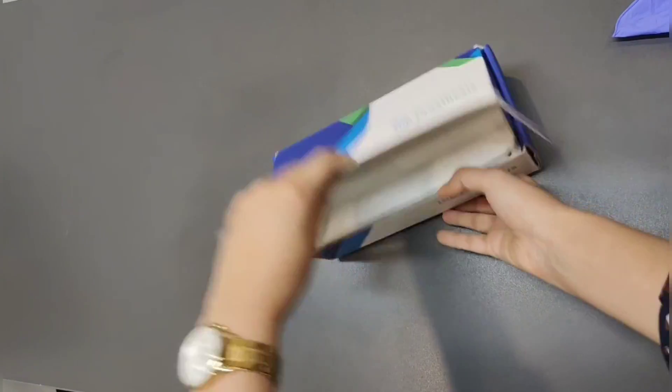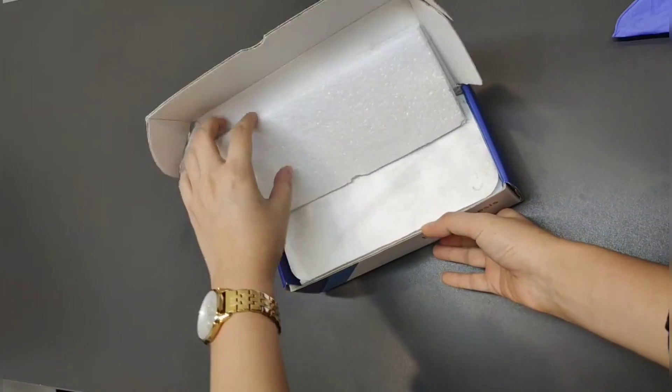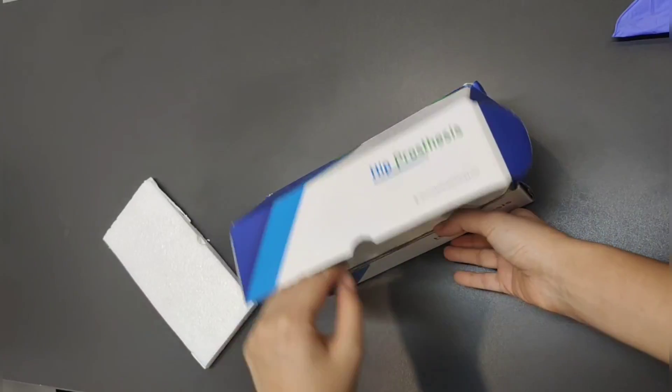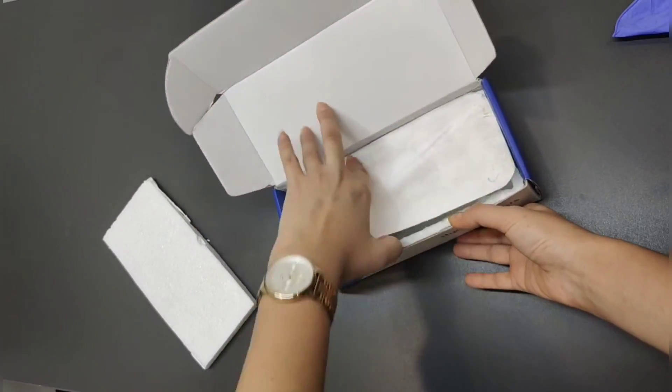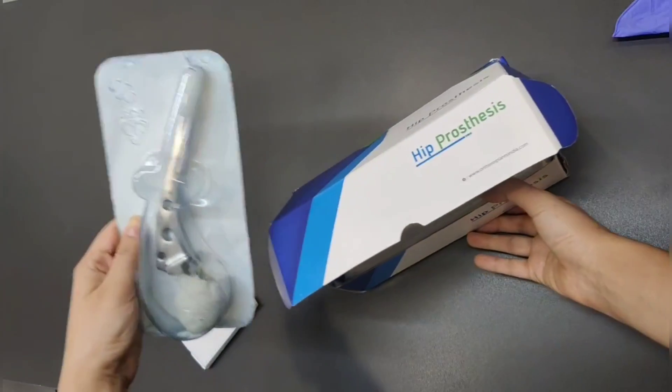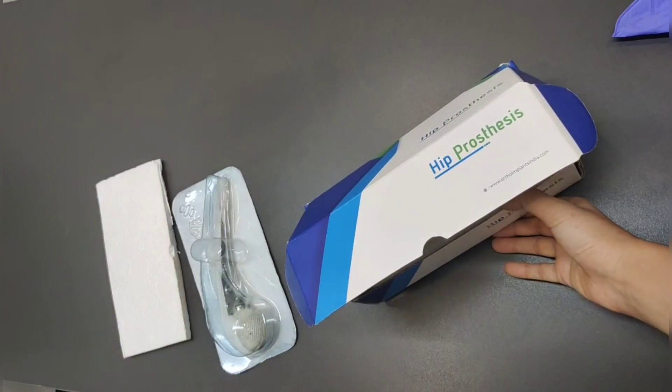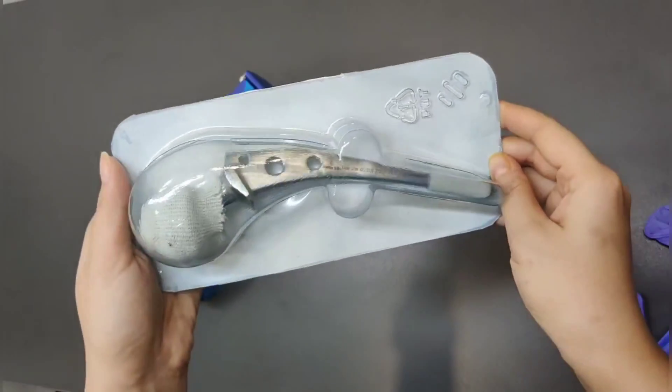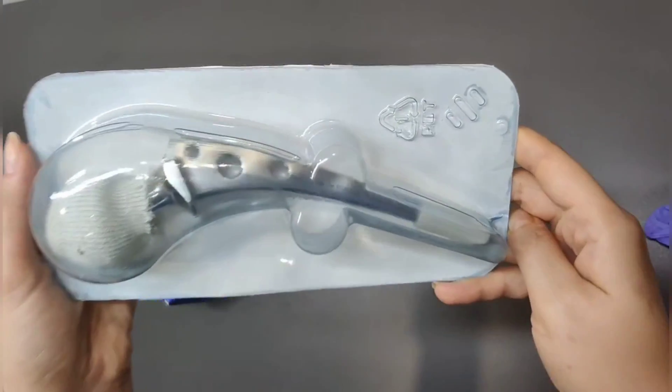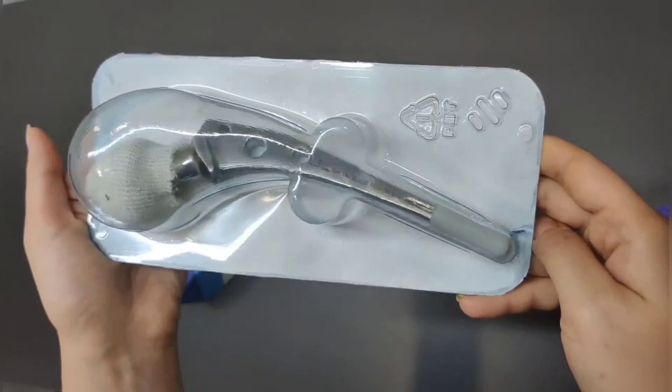The key advantage of the Zilmax Bipolar Hip Prosthesis is its ability to reduce acetabular destruction by preventing grinding of the prosthesis against it. As the patient walks, the prosthesis facilitates its own movement, minimizing damage to the acetabulum.